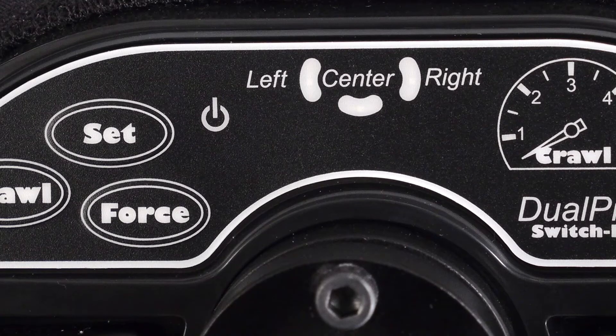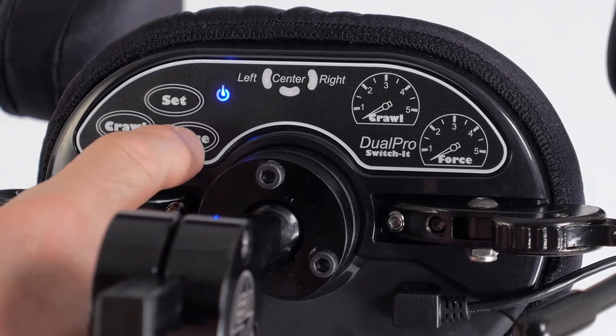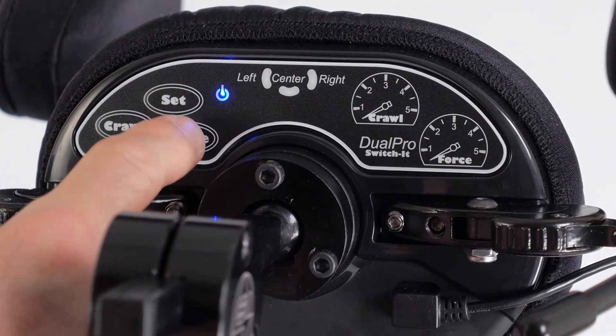When the system is turned on, a single blue power light indicates that the head array is operational. In its normal operating mode, the entire back panel is locked out and the buttons will not respond to touch.